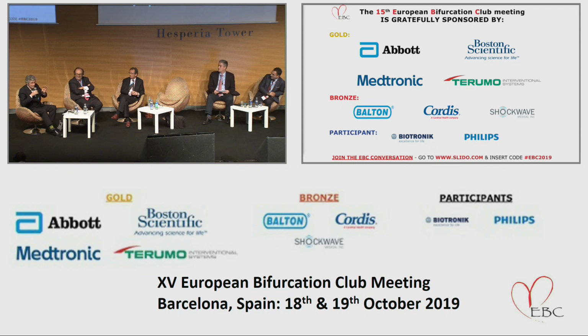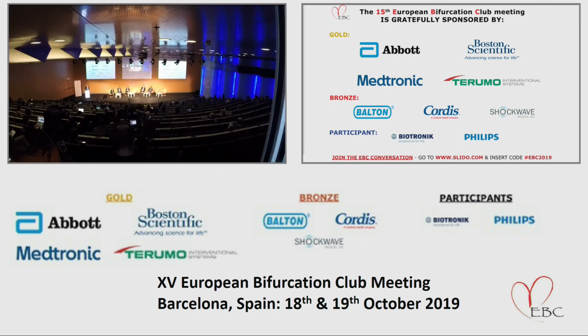I think it's very important to have that in mind, and Nicolas Foin has done this work, and I think you should have this figure in the cath lab to understand what you are doing. The Megatron is different, because although 3.5, 4.0, 4.5 is the same, the design of 3.5 is completely different as compared to another 3.5. And it could be different if you are going off nominal pressure, or very high pressure, that could make a difference as well.